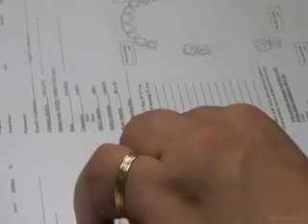The case after it, 2 pages after, here I need to add for indirect retention. Although my components are all complete in this case, this is the fulcrum line. If this is my fulcrum line, I have all components here and I can place some of the components. I'm going to eliminate on the center some of them. But the idea, I can place my components, but here I'm adding for indirect retention and for cross-arch stabilization together. I need to extend my design posteriorly. Okay?